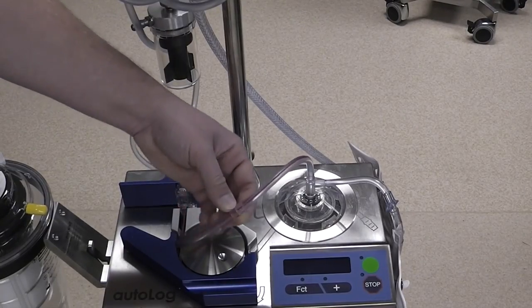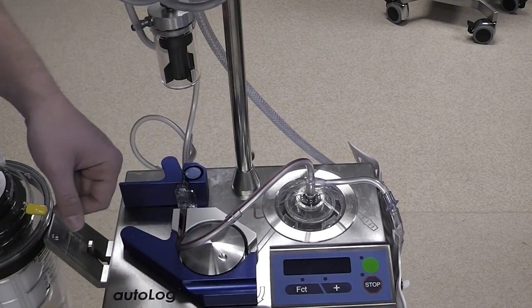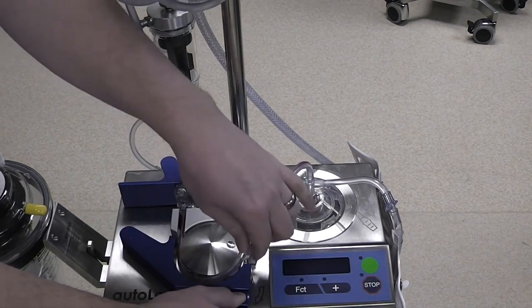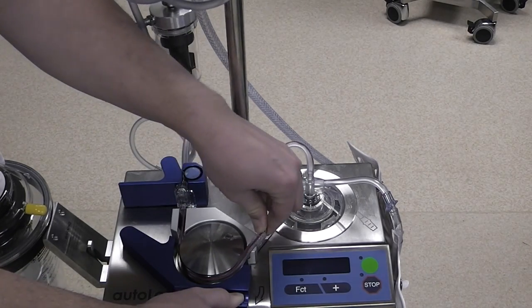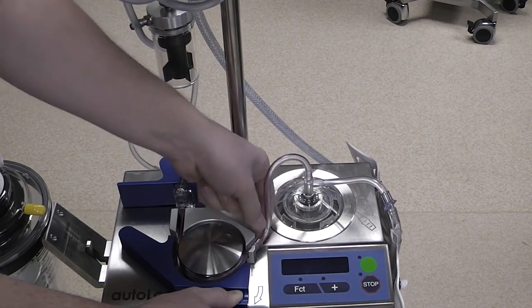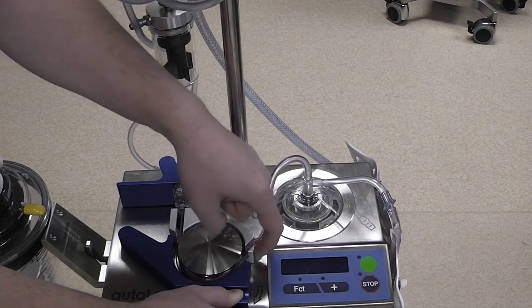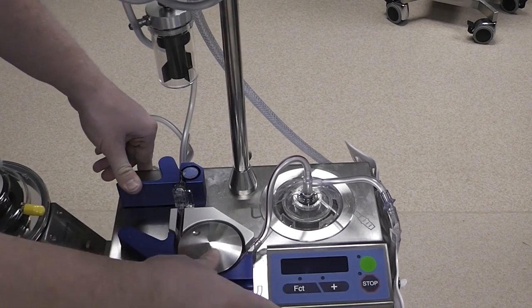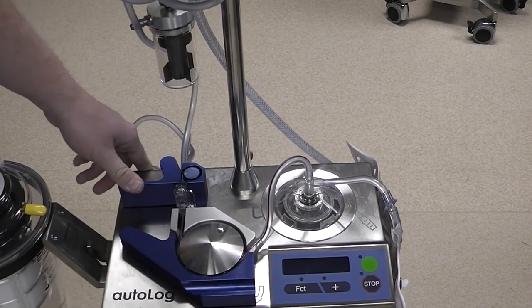Next we want to note this fitting on this tubing with the red line. We are going to open up this lever, insert the tubing into there, again keeping the red line on the tubing facing up, stretch it a little bit, and then seat that fitting in the back of the slot here. We can close that lever and rotate this wheel a few times to make sure it is fully seated.